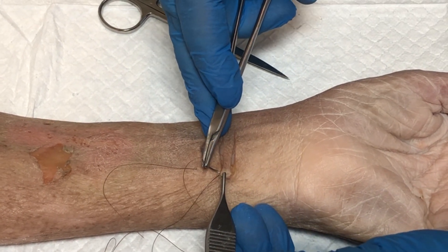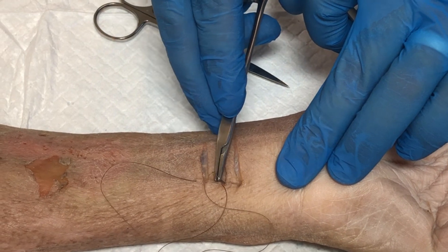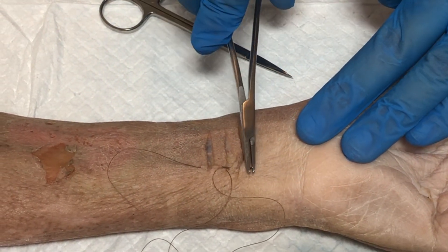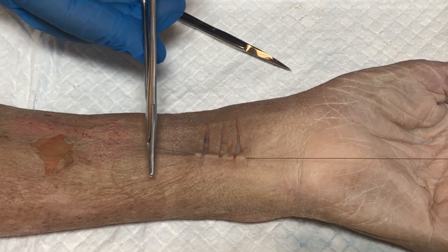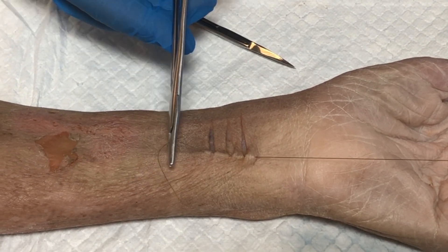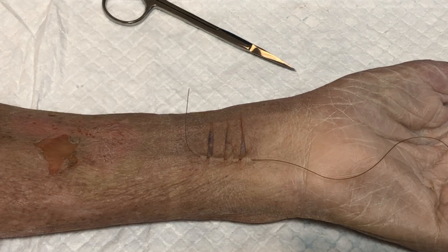We're going through the dermal layer. Use the needle driver to pull the thread all the way through. You can see that you're taking your suture material and going through the dermal layer all the way down towards the distal aspect of the wound, and then we're going to reload the needle driver.